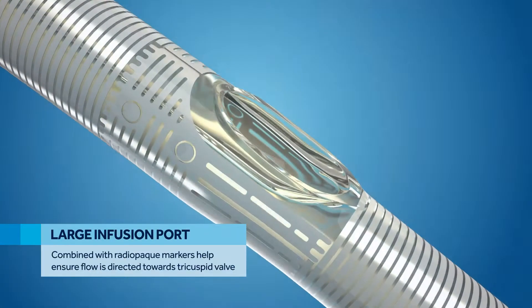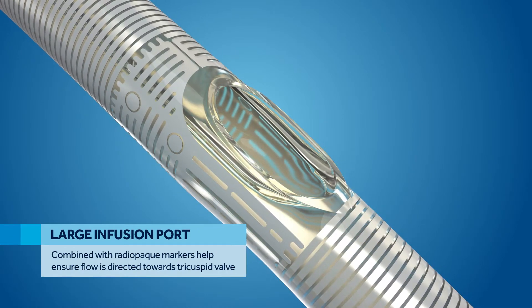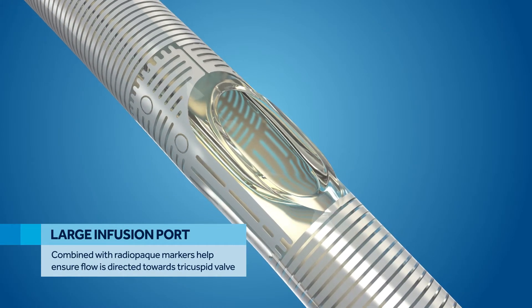The enlarged infusion port design, along with the radiopaque markers, helps ensure flow is directed towards the tricuspid valve.